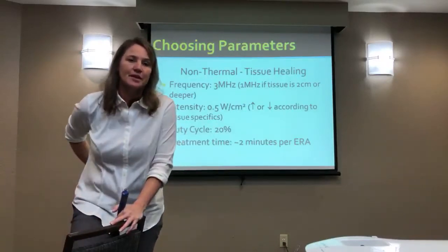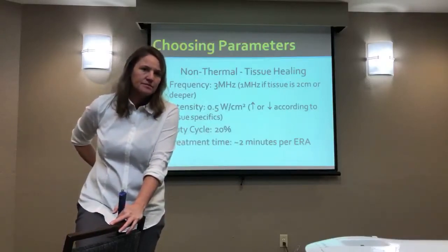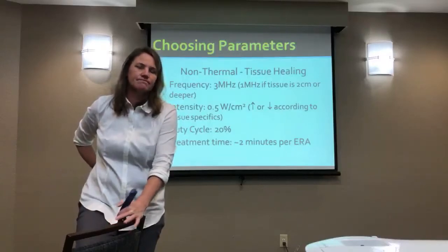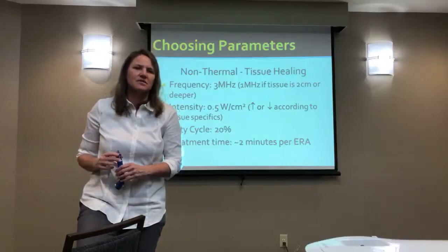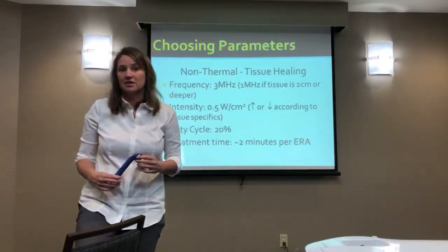Yes, ma'am. So I have a question. These portable units are calibrated to a certain intensity. So how do you change? You can't change anything. You have to use it at that intensity. Do you know what intensity yours has? I'm not sure. I mean, that would be my question: can you even compare?